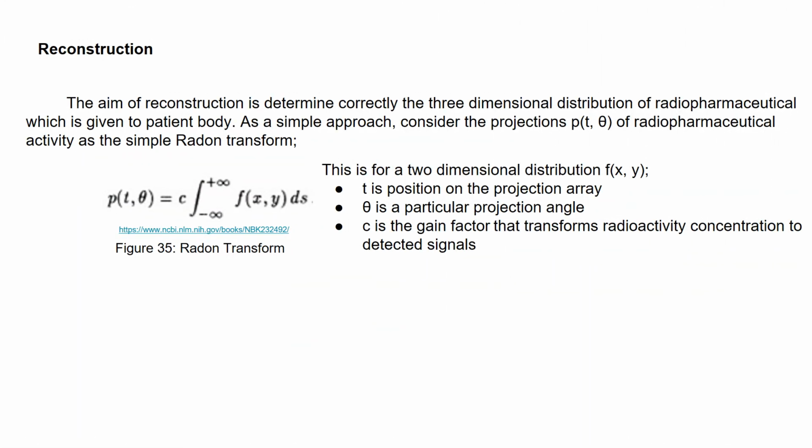Reconstruction is the process of determining the three-dimensional distribution of radiopharmaceuticals which are injected into the patient's body. To understand the main logic of reconstruction, the Radon transform, which is for two-dimensional distribution, can be used for explanation.